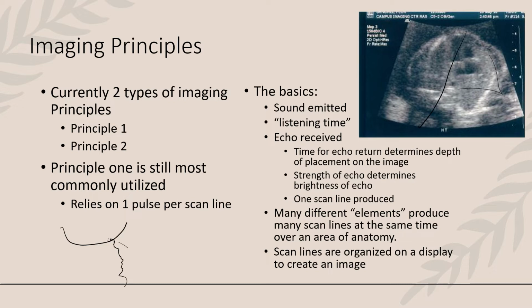Okay, now obviously we don't have one element working at a time in this principle 1. We have many elements across the top of our transducer here that are working together to produce numerous scan lines and create our image.